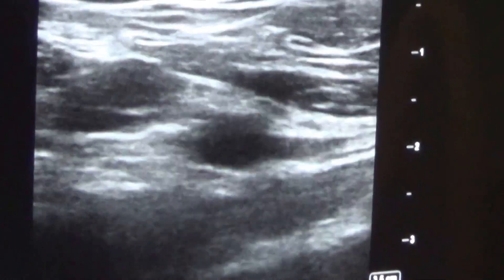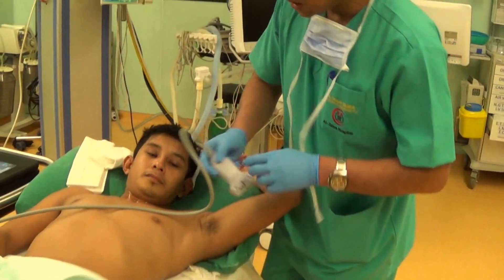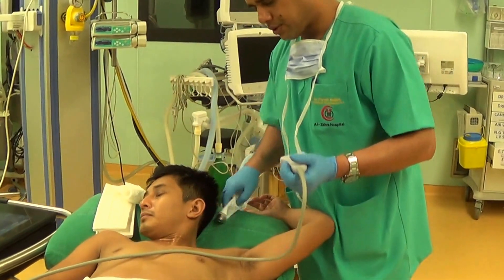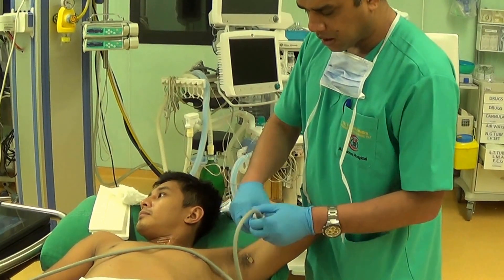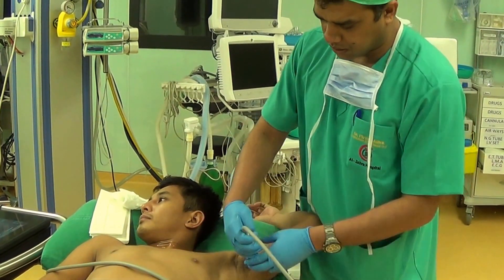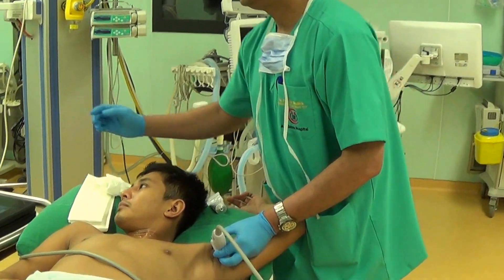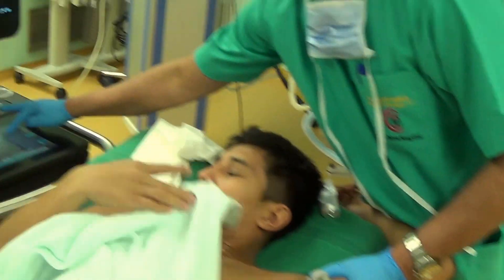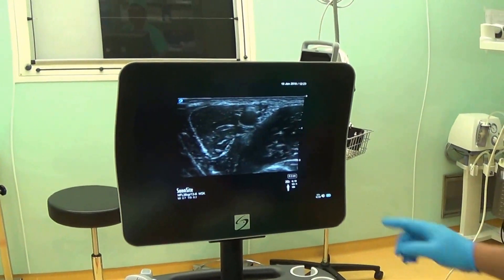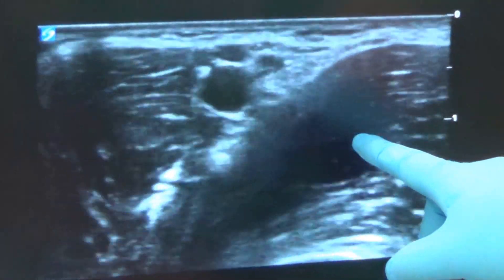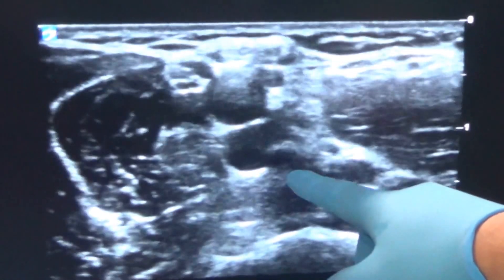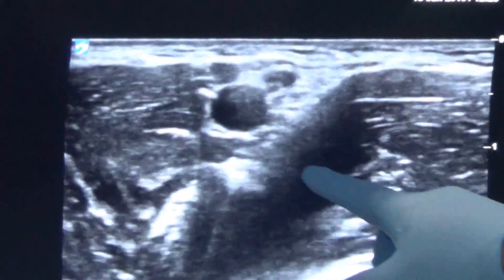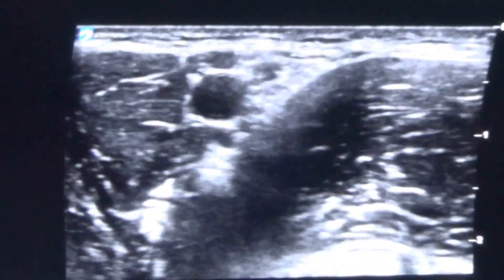Now let's go to the axillary block. The patient puts his hand in abduction and we look for the axillary artery — once the axillary artery is visible, our job is done. This is for the axillary block for peripheral surgery. Once the axillary artery is found, you start seeing the nerve roots around it. This is the vein, and this is the artery.